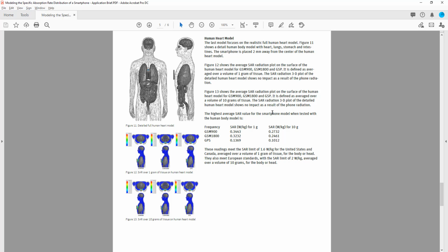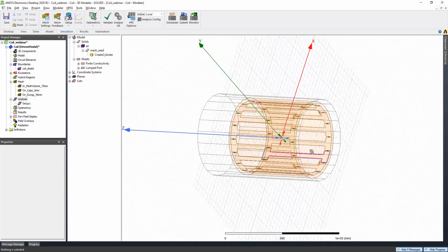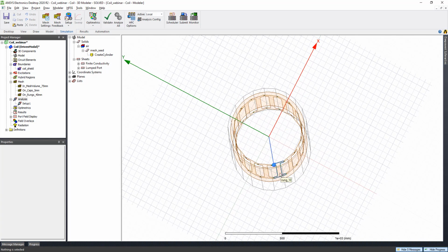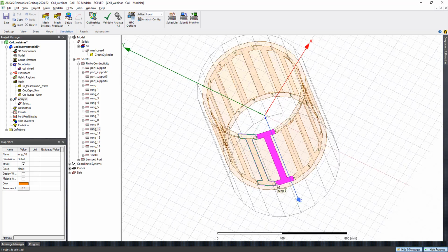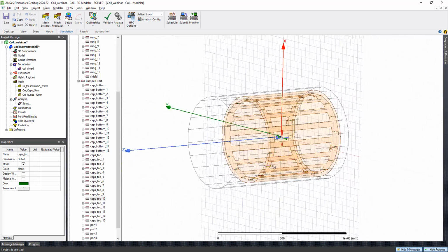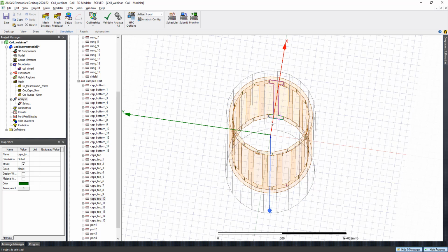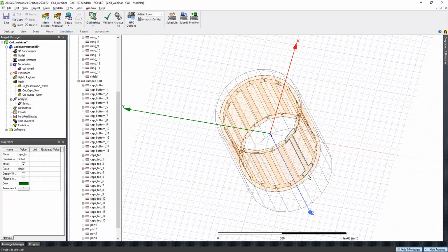But next, I'm going to jump into today's design. Today, what we have is a simple MRI system. This is made of just simple coils with some tuning capacitors on it. We are going to simulate this first, and after this we are going to have a gel model right inside these coils. We are not going to use the real human body today because that will consume a lot of simulation time.